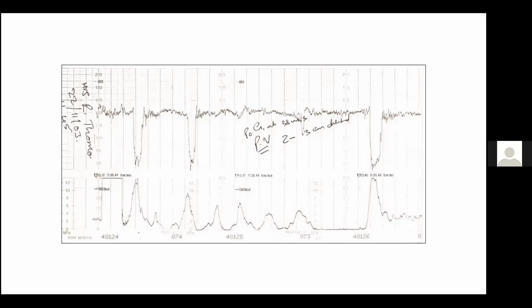So that is worrying because if the heart rate slows by more than 45, it's a worrying sign. Then in terms of timing, they were happening with the contractions, but after the decel, there's even an acceleration. So there is a good recovery. So if we're looking at this trace, we won't say these are early decelerations. We're going to call them variable decelerations. So what are variable decelerations? The deceleration is variable if the reduction in heart rate is more than 45, and we're not going to refer to it as an early deceleration. Now we're going to call it a variable deceleration.